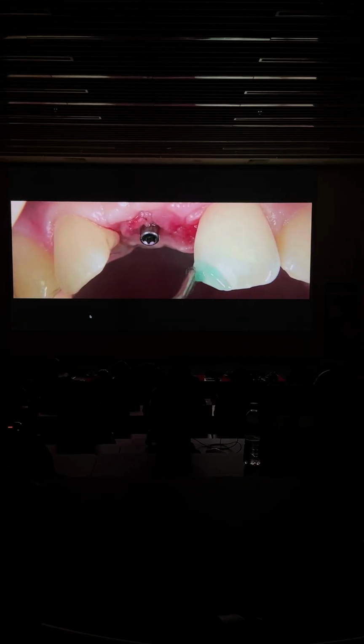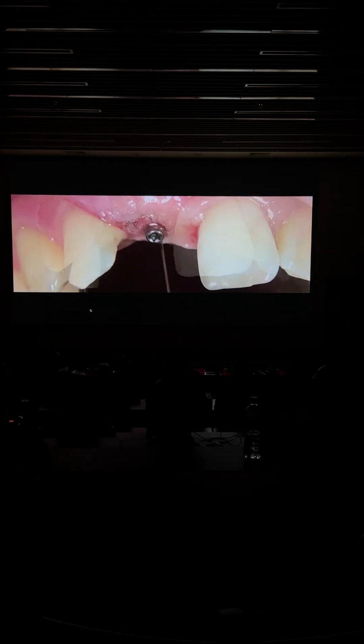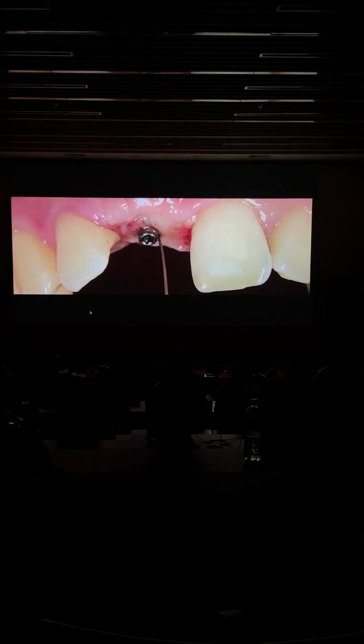Sorry. You can see here, now we're going to do our composite, simple composite, dentin and incisal halo, nothing really difficult. I'm going to polish. If you look at my book, in 90% of the single tooth implants, the adjacent tooth has a composite to improve the contact point. This is the final zirconia abutment with the titanium base.